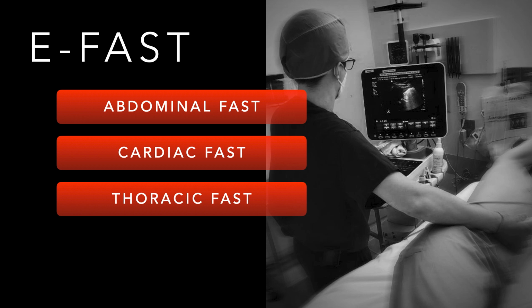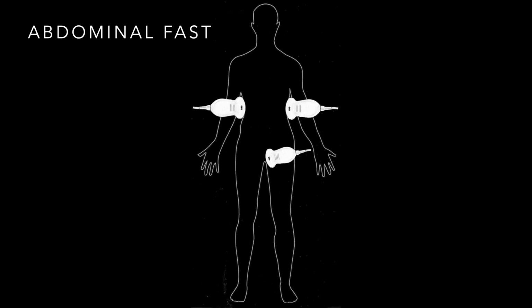You'll be able to go back and watch the whole thing, with all the expansive detail that we talked about last week. But by way of review, the abdominal FAST is comprised of 3 specific windows, right? The right upper quadrant, left upper quadrant, and the pelvic window. Now you say, hey, there's 4 windows. Yes, part of that's the cardiac FAST. But the component that's looking specifically at the abdominal cavity, the peritoneal space, is these 3 windows: right upper quadrant, left upper quadrant, and pelvis.